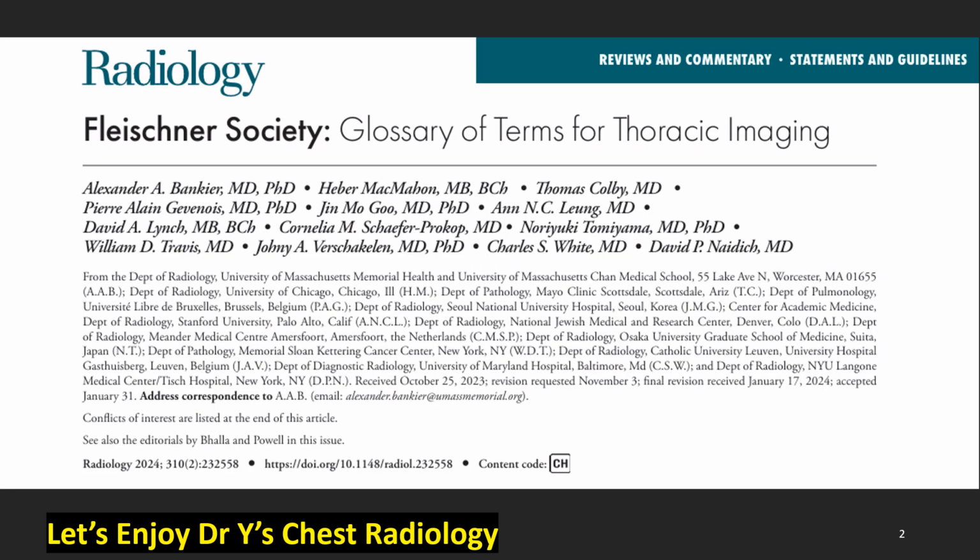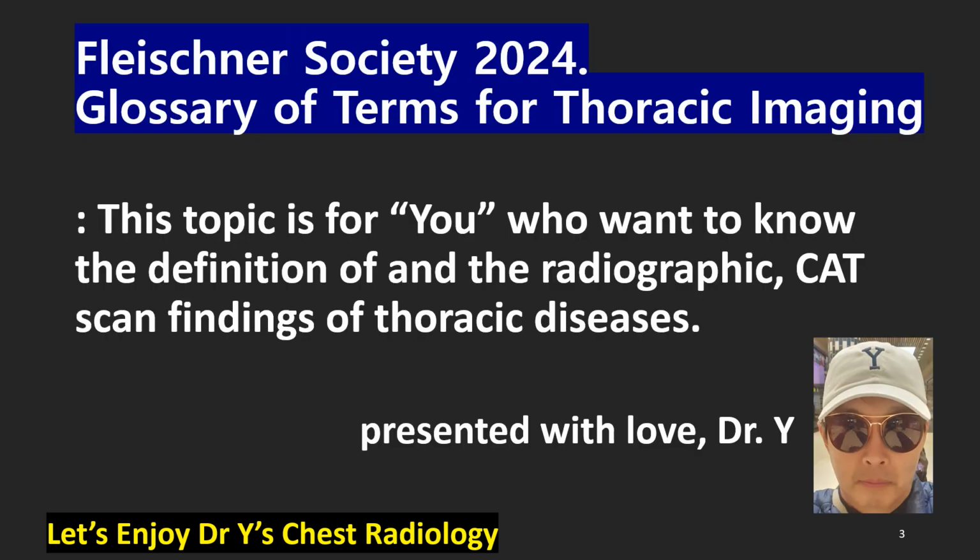This topic is based on the Radiology review and commentary, statements and guidelines: Fleischner Society Glossary of Terms for Thoracic Imaging by Alexander A. Bankier et al., Radiology 2024, 310. This topic is for those who want to know the definition of and the radiographic and CT findings of thoracic diseases.